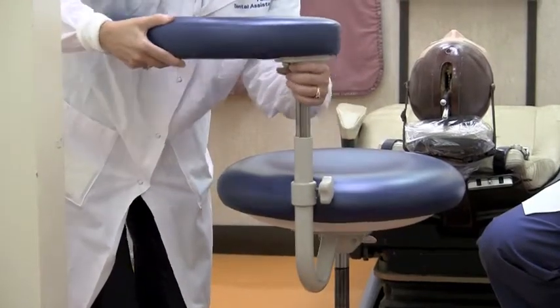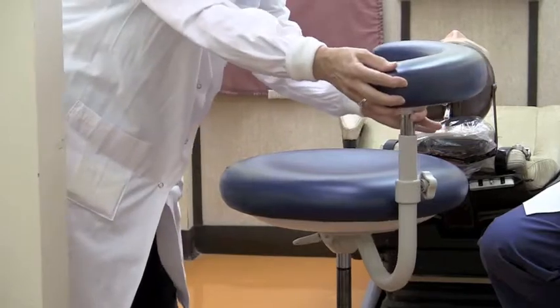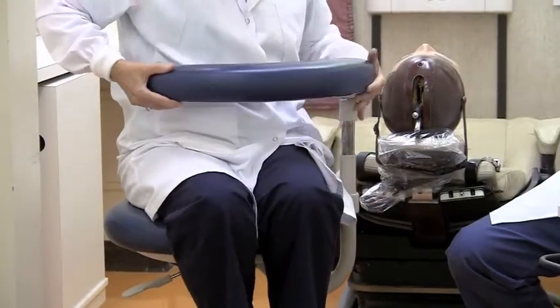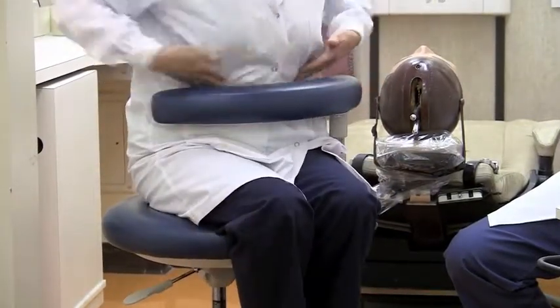Loosen the screw knob located at the base of the support to raise or lower the arm. Pull up on the metal cylinder under the support arm to allow it to swing freely. When seated, the support arm should rest securely at the base of your ribcage. Make any adjustments as needed.